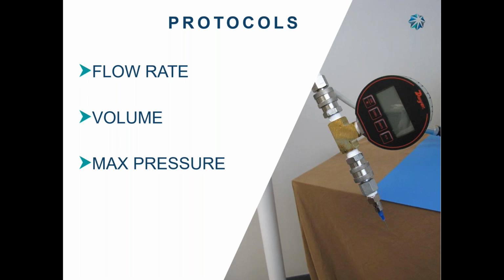They want to see what's going on. So they don't need the saline. If they want to do a saline, they'll take a little syringe and flush it out. They don't need it. And they want that fast flow rate to get into the body as quickly as possible, because they have a catheter either going through the arm or up the leg, sitting in that heart. And when they want to see the contrast, they want to see it.